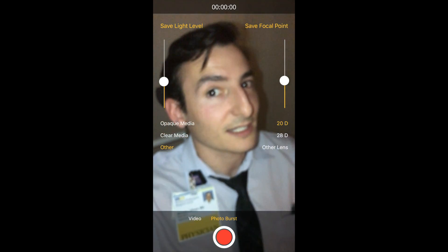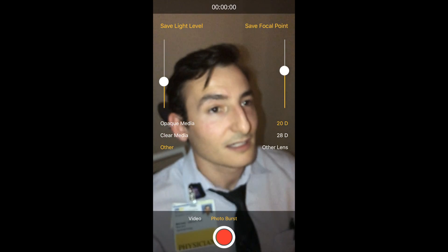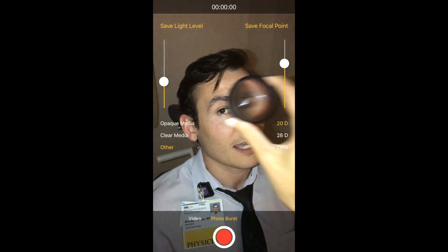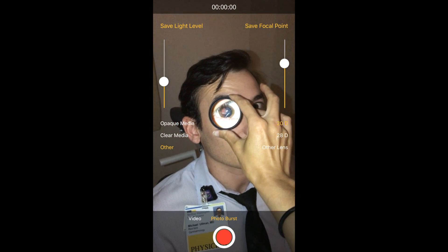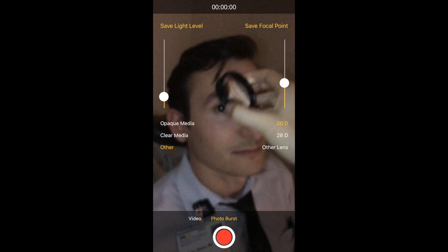Then you're going to want to change the focal point. Then you want to put the indirect lens over the eye, just as if you are doing a regular indirect exam.